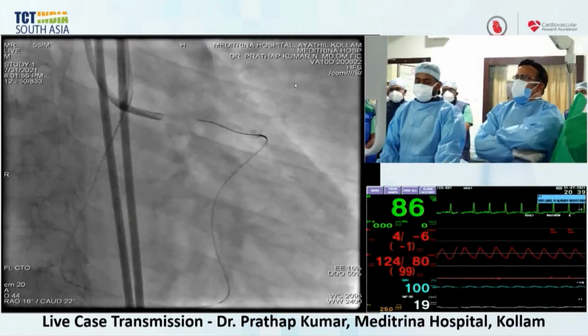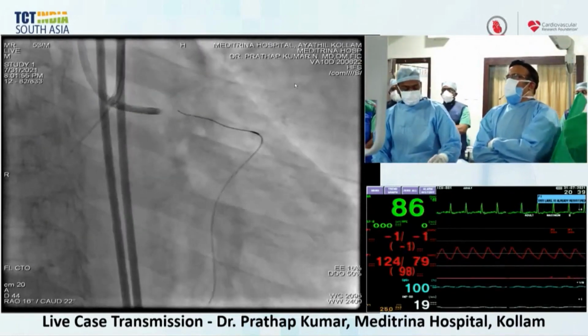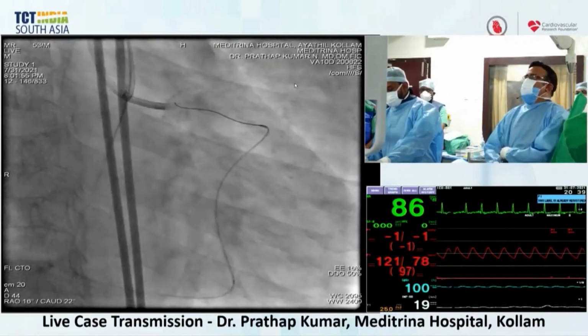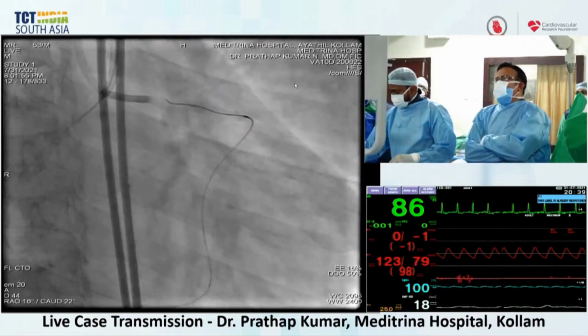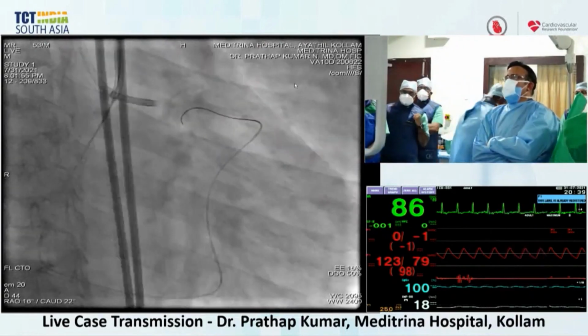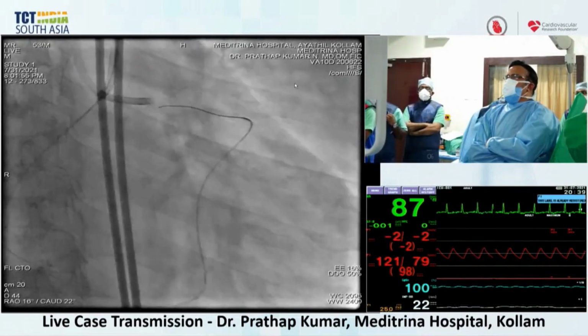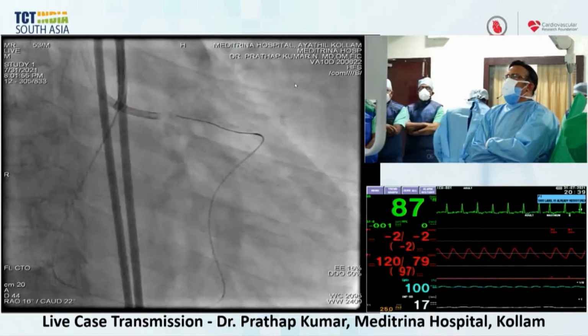Sanjog, can you see us? Yeah, we can see you. I'm actually sorry that the connections are totally gone. Dimitri, myself, and the entire panel are here. Please, this was the position we left. Actually, the wire is going inside. Can you see? Yep, we can see it. Okay. We were discussing the strategy that was used when the audio went out.